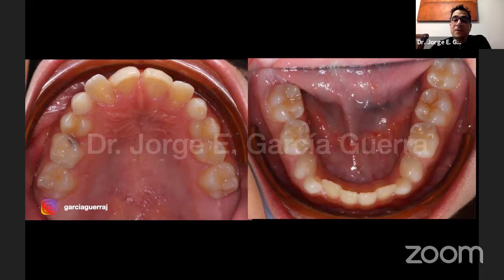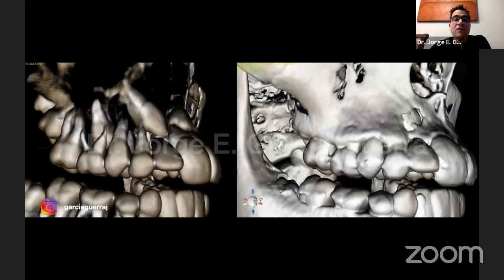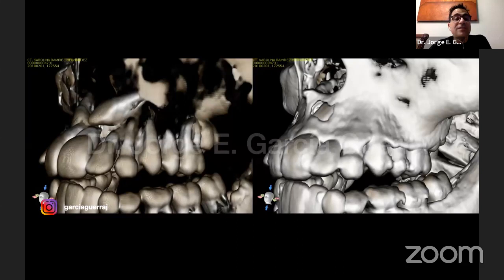Now we obviously do a CBCT. I strongly recommend you do this in every case where we have impacted canines, because you can see here how the canine was on the root of the lateral incisor. That's why we had the lateral incisor with that inclination. That's the right side. On the left side, it was more by the root of the central incisor. We can talk all day about the benefits of the CBCT, but the greatest benefit is that we can see where it is.